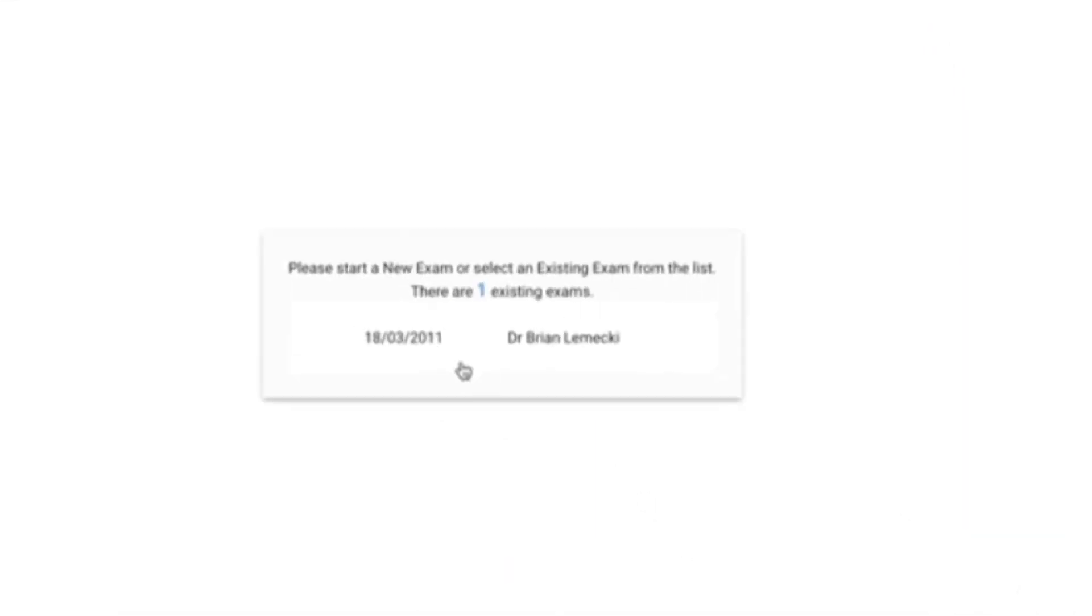Now for this particular patient, this is saying that they already have an existing exam. I can choose to look at this exam if I want by clicking on this date with the provider.